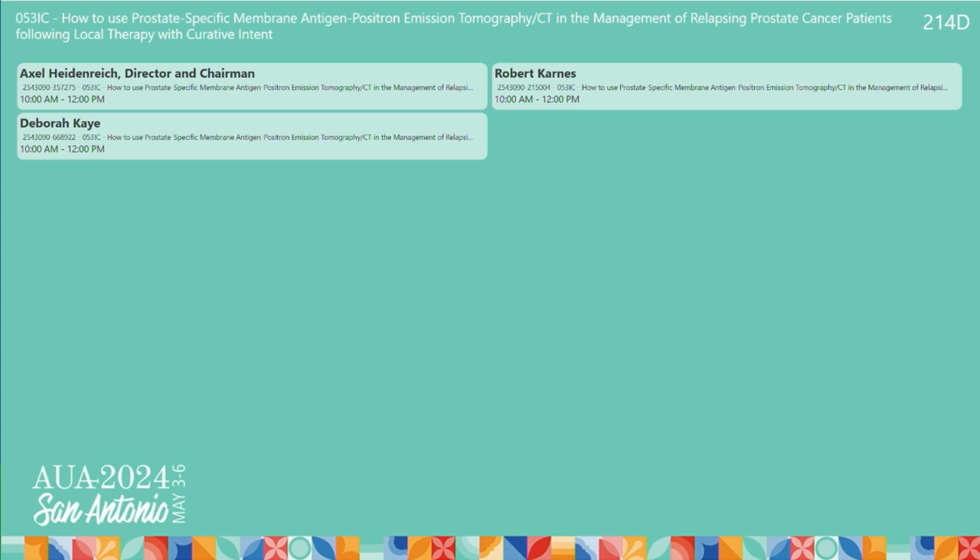In this situation, the PSMA PET scan was negative, doubling time was moderate, so I usually get the next PSMA PET scan if the PSA rise is above 2, because then we know these primarily negative patients usually will switch to positive patients. If, however, there is still, with a PSA of 2, a negative PSMA PET scan, I would go back to the histology.